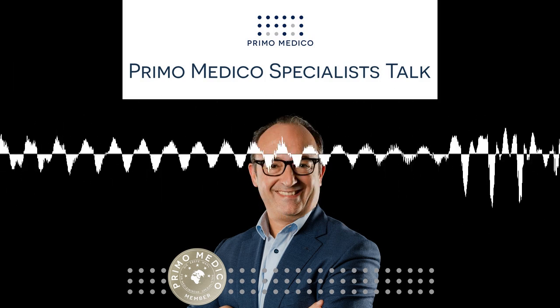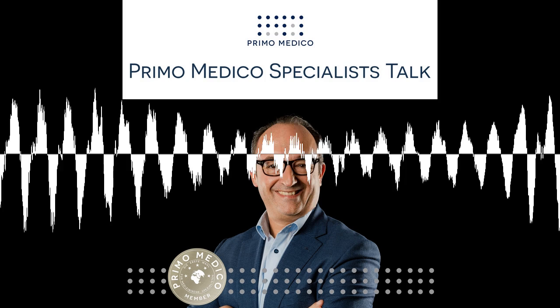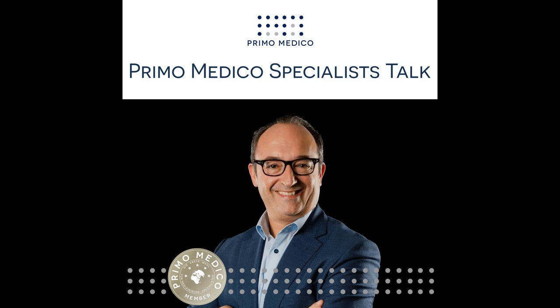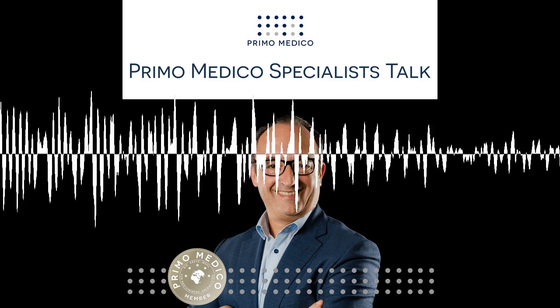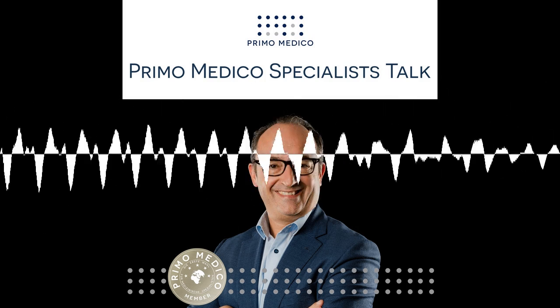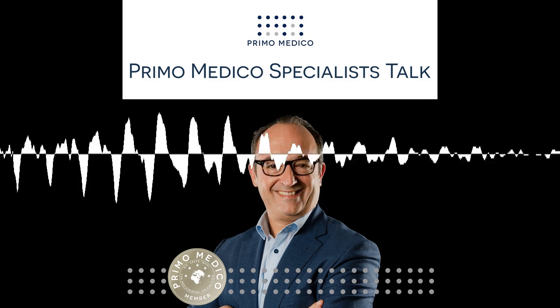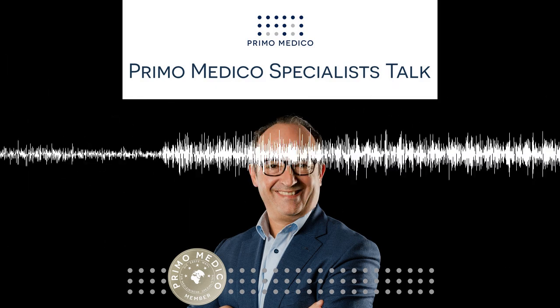Partial means we take maybe one component of the two metallic components and we exchange the inlay at the same time and do maybe additional surgeries, or we build up the bone. A total revision would mean everything is so loose that we take it completely out and we do a bone filling or implant then a revision total ankle arthroplasty system. So after a loosening total ankle, the chances are very high that we continue with a new total ankle for another 15 to 20 years.